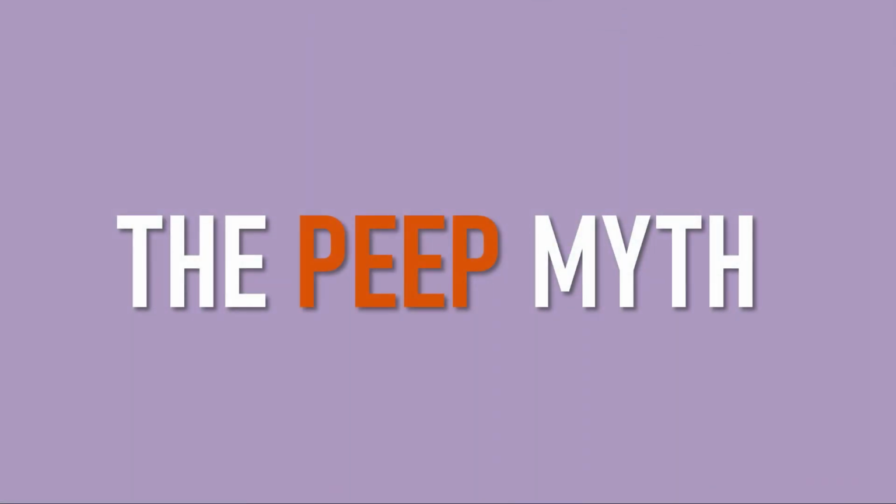Let's scroll back a little bit and look at PEEP. It's widely believed that if a patient is becoming more hypoxic, they always require more PEEP, and that is just not the case. Remember from previous tutorials that PEEP is used to both treat hypoxemia and to improve lung compliance. It also has a benefit in preventing lung injury associated with recurrent opening and closing of collapsed lung units, and this is known as atelectrauma.